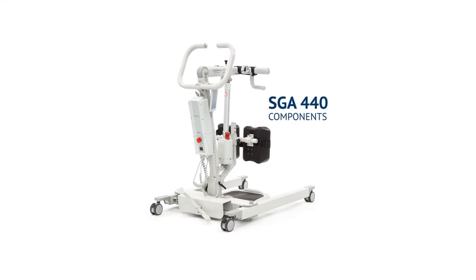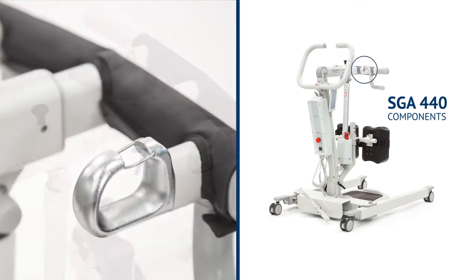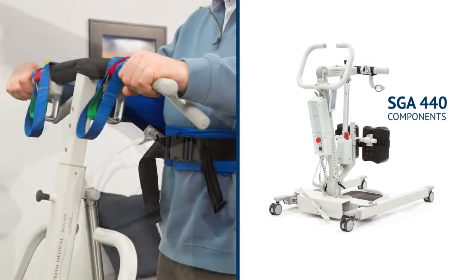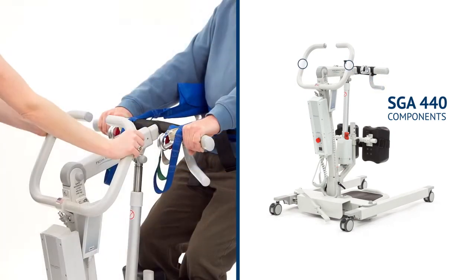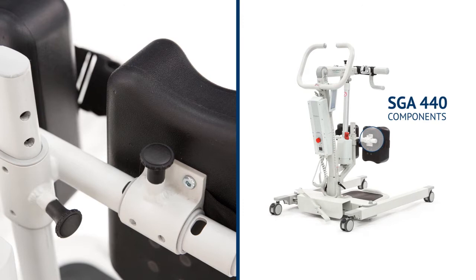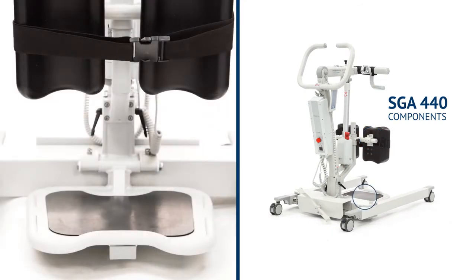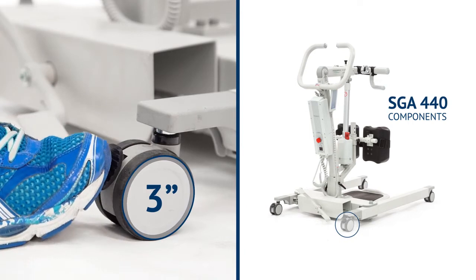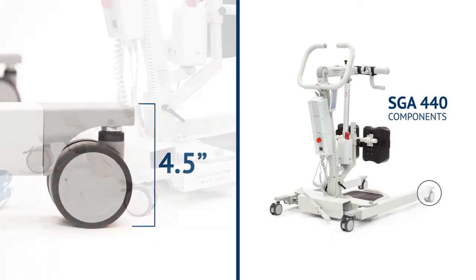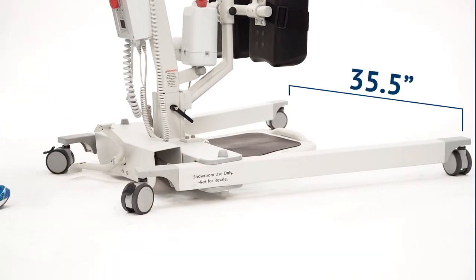Components of the SGA 440 are the mast, the actuator, the boom and yoke which allows for 7 inches of adjustable length, sling connection hooks with safety clips, patient grab handles, ergonomic push handles used by the caregiver to move the device, chin pads with adjustable height and width, safety straps with buckles for securing the patient's legs, a foot plate, and legs which come standard with 3-inch locking wheels with a total height of 4.5 inches. A manual leg width spreader has a minimum leg spread of 22.5 inches at the inner front end of the legs and a maximum leg spread of 35.5 inches.